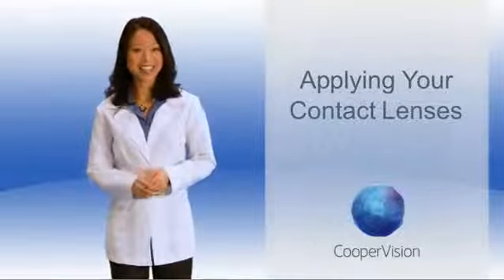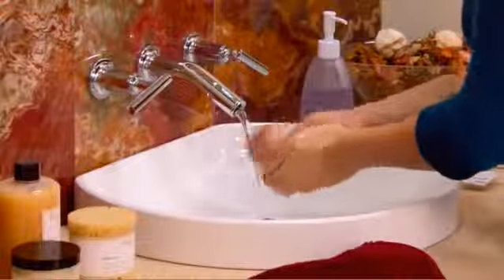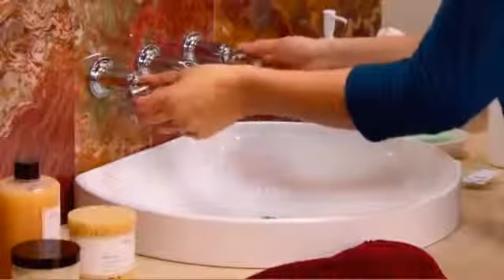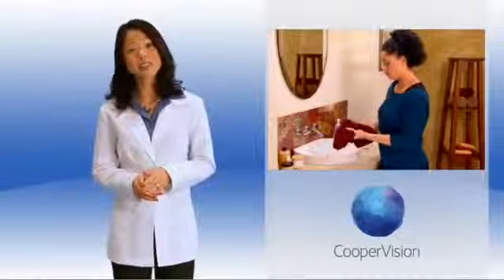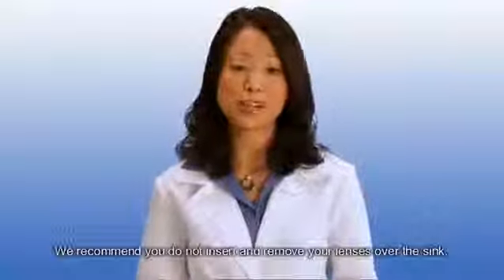Let's get started. First, always begin by washing your hands thoroughly with mild soap before any interaction with your contact lenses. Rinse and dry your hands completely with a lint-free towel. Moisture from your finger could cause a soft lens to flatten, and if your hands are wet, a contact lens could stick to your finger. If you're near a sink, close the drain or insert a drain plug to avoid any mishaps.